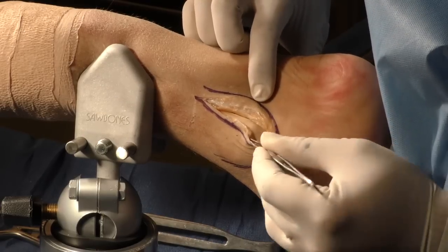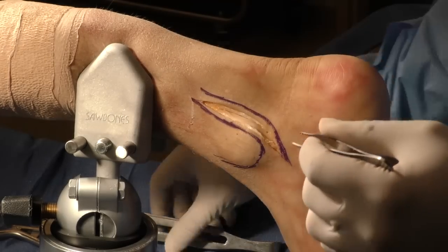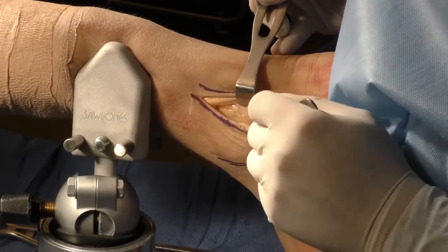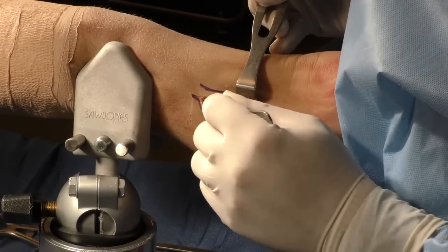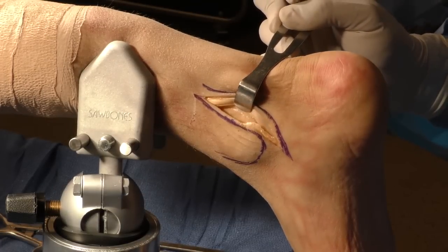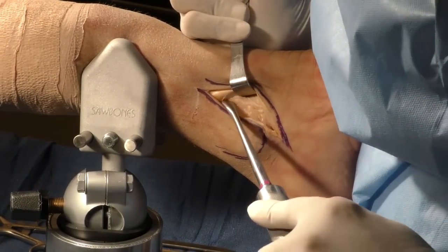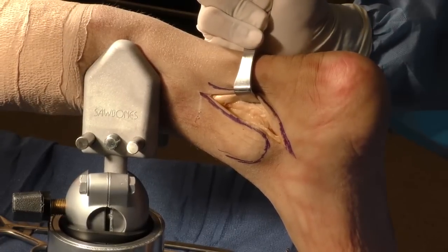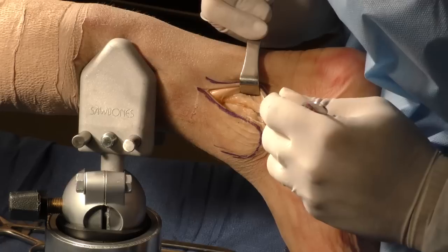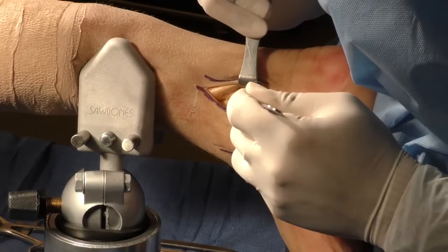If you need to dissect further across, that's typically not necessary, but it can be done using a Chandler, a Cobb, or whatever you want to use. You do have to incise the periosteum — that's something I think is very important. When you look at posterior tibial fractures, the posteromedial fractures, the periosteum is quite good. If you incise the periosteum, just be careful because you do not want to injure the nerve. You can get a much larger exposure across the entire tibia, and you can see that the entire posterior tibia is exposed without really any risk of getting into the neurovascular bundle.